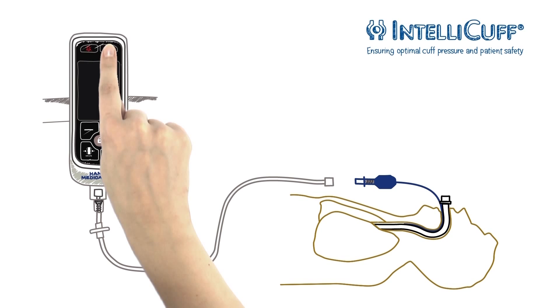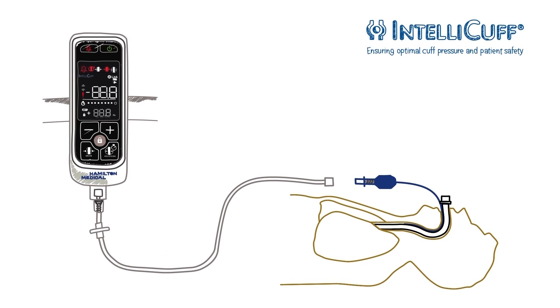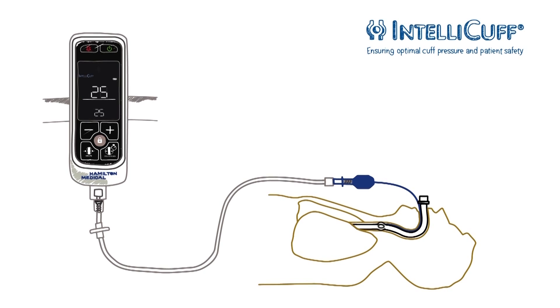To turn on the device, long press the power button. A self-test is performed. When the target pressure blinks, the self-test is successful and the device starts applying the set default pressure of 25 cm of water. The cuff is inflated. IntelliCuff is designed for immediate use — no calibration is required.